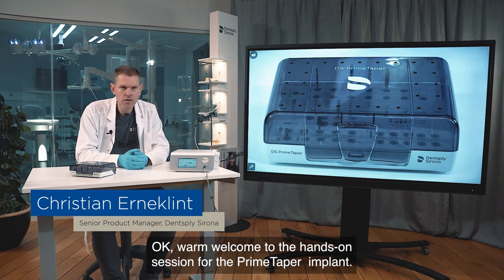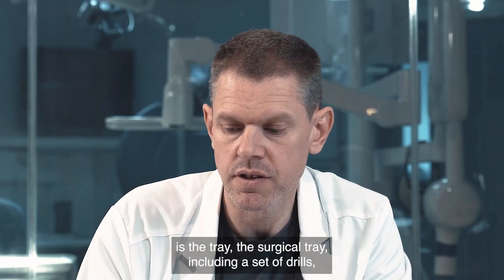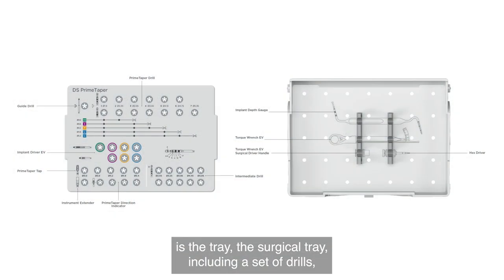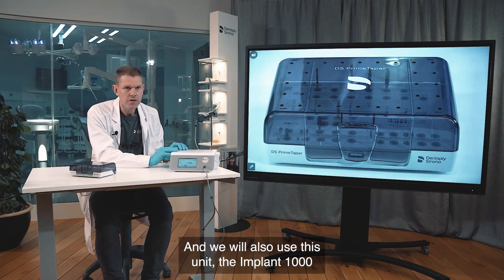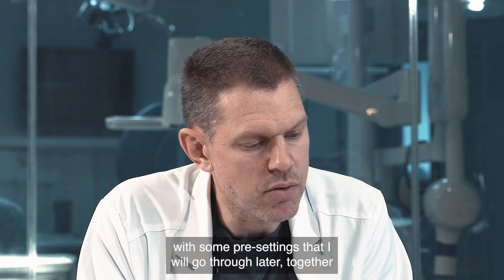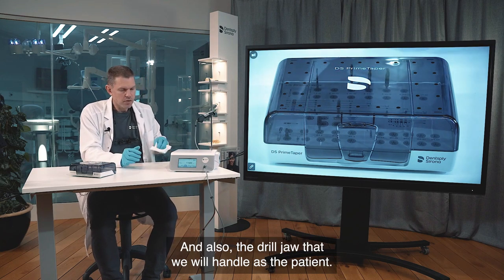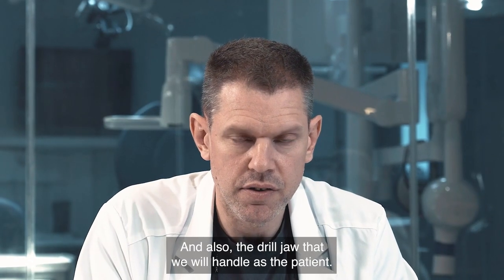Welcome to the hands-on session for the Prime Taper implant surgical procedure. During this session we will handle the surgical tray, including a set of drills, implant driver, tap, direction indicator, and more. We will also use the implant unit with some pre-settings I will go through, together with the handpiece and the drill jaw that we will handle as the patient.